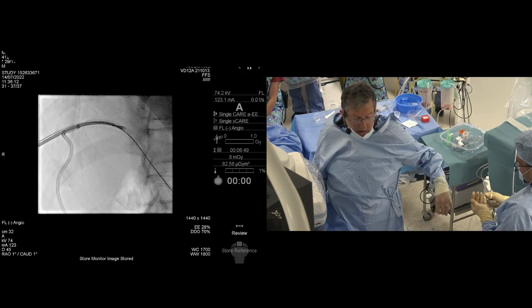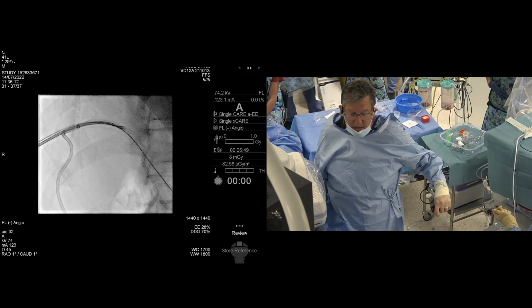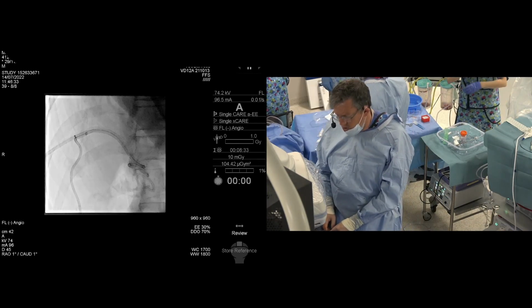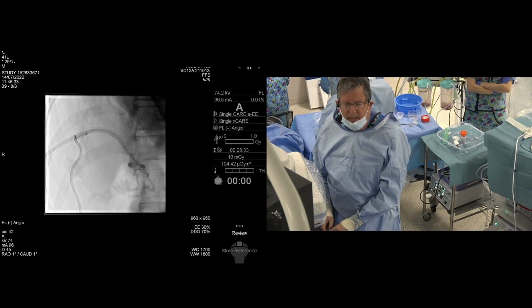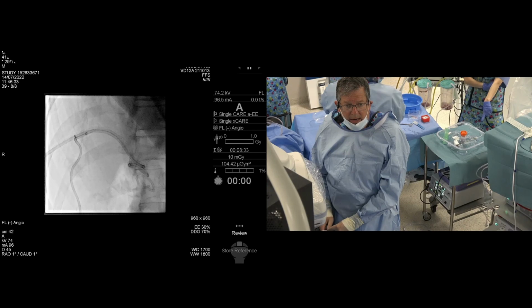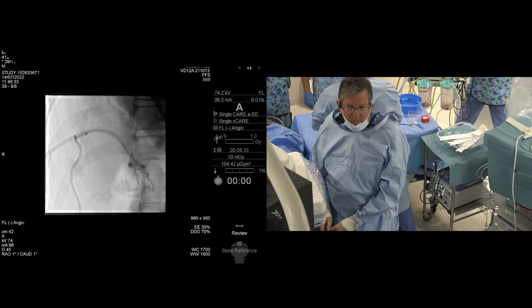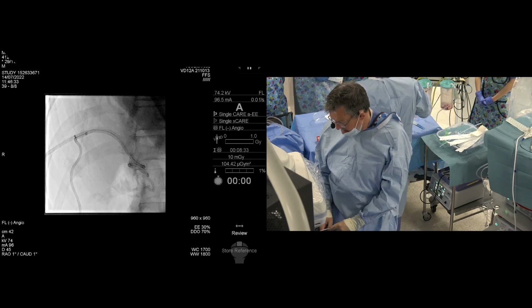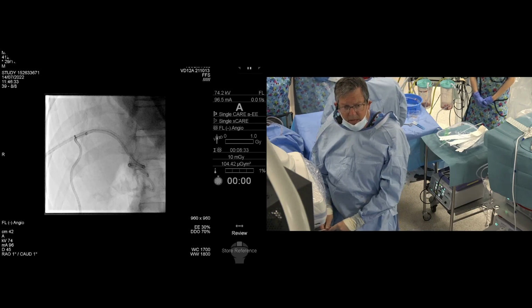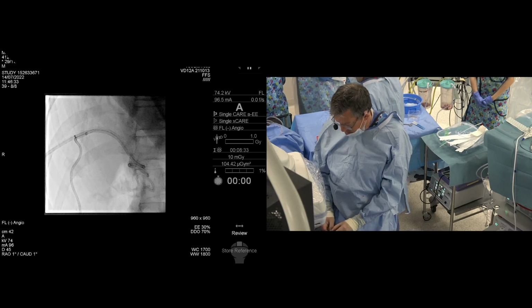Have we got decent biopsies? Nice samples, good. Okay, so in conclusion, I think that's a good procedure. I think we've really targeted this stricture. I don't know what the diagnosis is yet. Certainly, we've taken lots of biopsies, including Steris Infinity brush and Histoguide biopsies. So I think really pushing to make a pathological diagnosis. Good. Thanks so much.